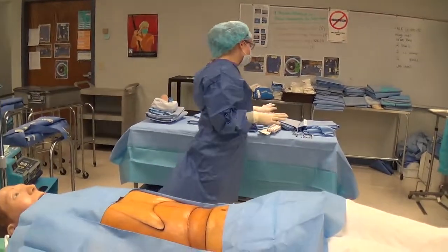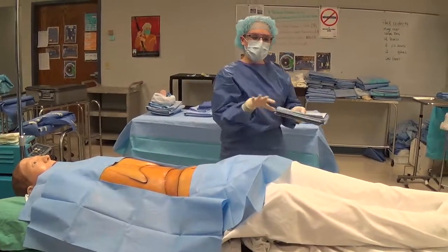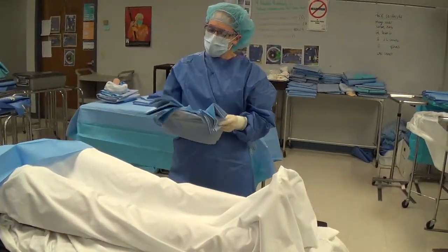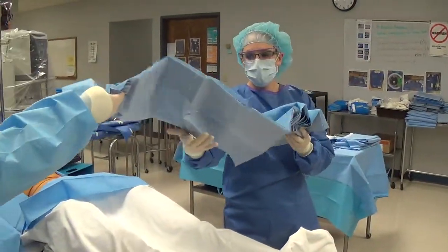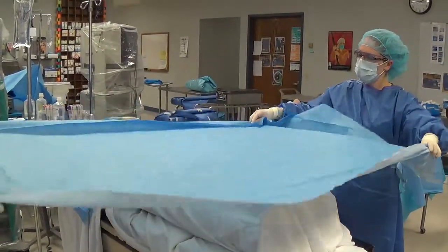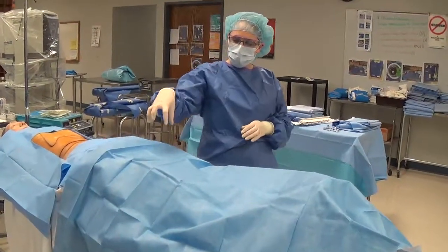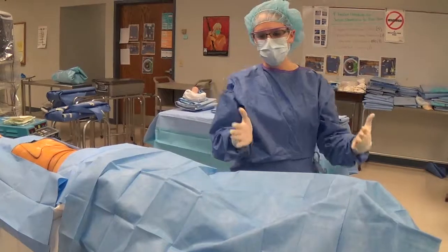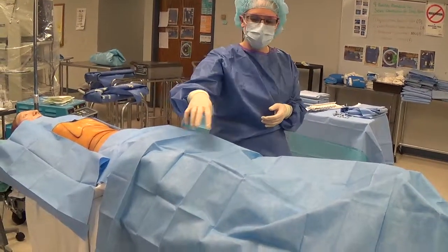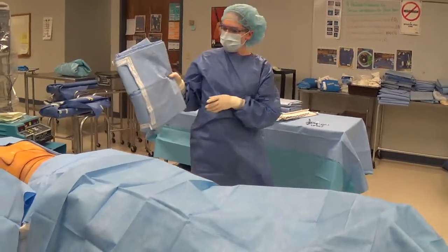Four square-off towels complete the first part of the laparotomy draping sequence. Some surgeons may use a medium sheet over the legs for an extra layer of protection. Hand that to the surgeon or whoever you're draping with, grab the edges and open it up — this provides an extra layer since instruments may be laid on the drapes here at the mayo stand as the surgeon and PA utilize them.